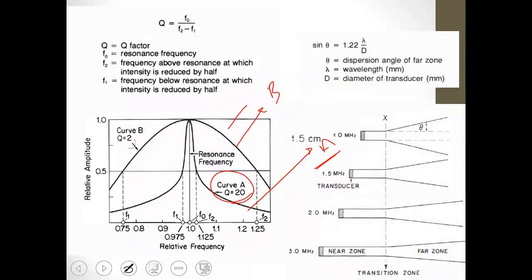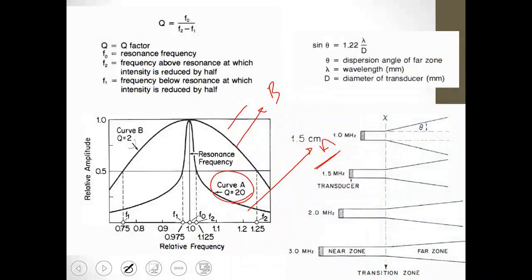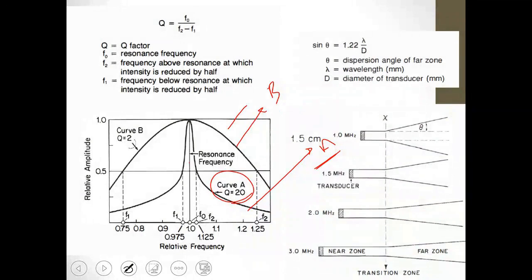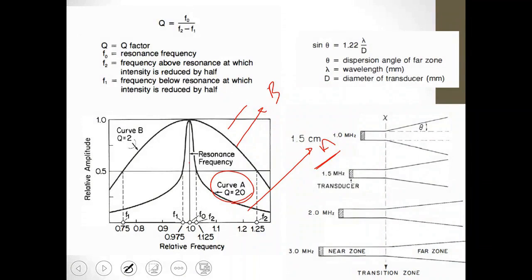In contrast, when using the Doppler, you are more concerned with the surface area and do not need to reach high depths. You just need high resolution. So, using a high-frequency transducer gives you your resolution, as we will discuss later regarding image quality. The advantage of high frequency is that it allows you to deliver fast pulses to reach a specific object inside the body.